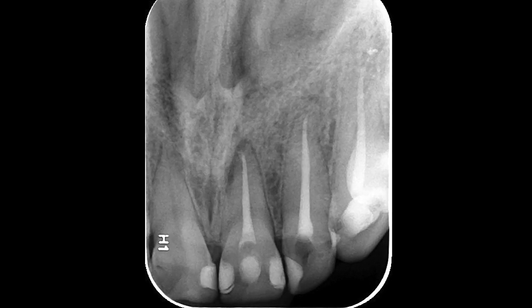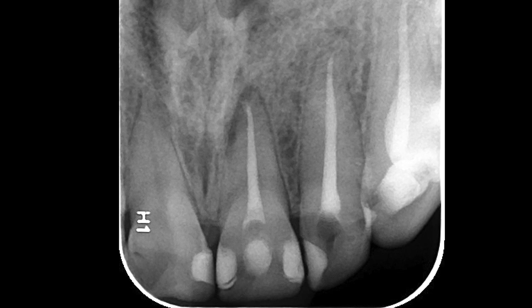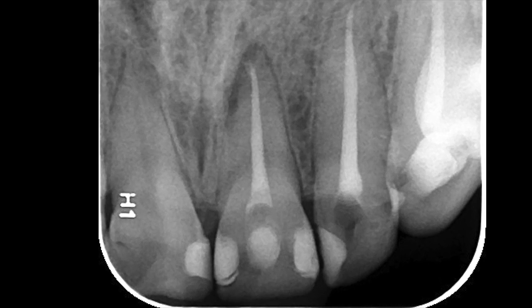The final X-ray confirms appropriate obturation of the root canal system.